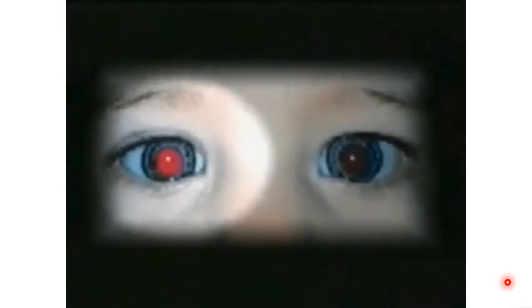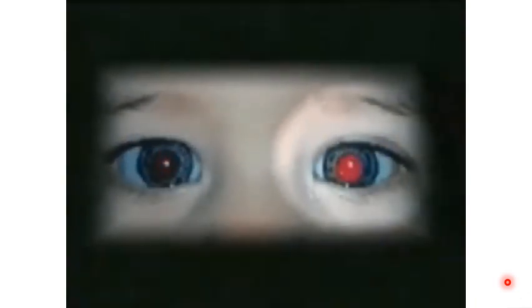We start by examining the red reflex. This is important to judge the clarity of the ocular media. If there is any kind of media opacity like cataract or vitreous hemorrhage or corneal opacity, the red reflex will not be bright. And then we move on.